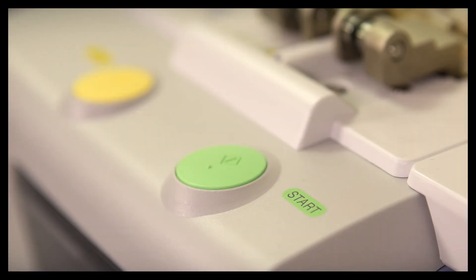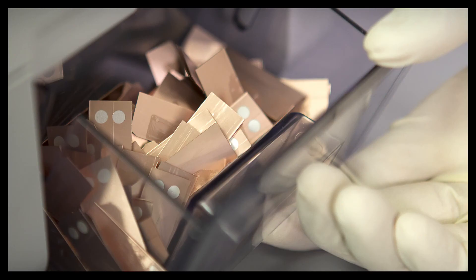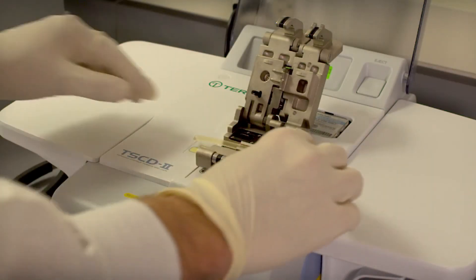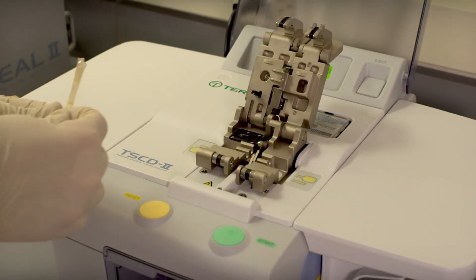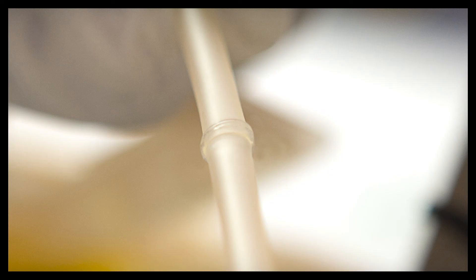Beyond simplicity of use, the TS-CD2 welder also ensures sterility. To cut and weld the tube, the wafer is heated to 300 degrees Celsius, which forms a sterile heat barrier. The contents of the tubing remain within a closed system and the result is a smooth, dependable weld.